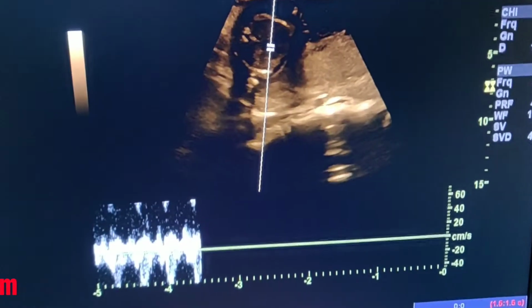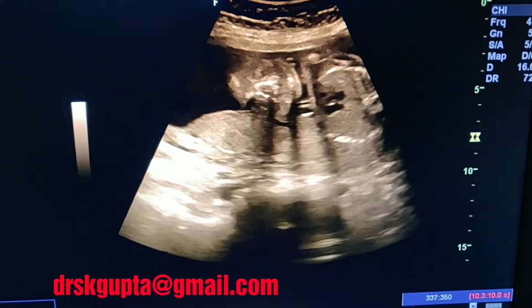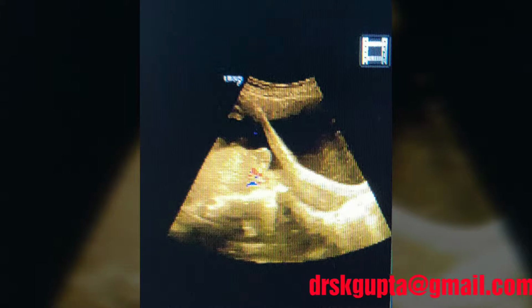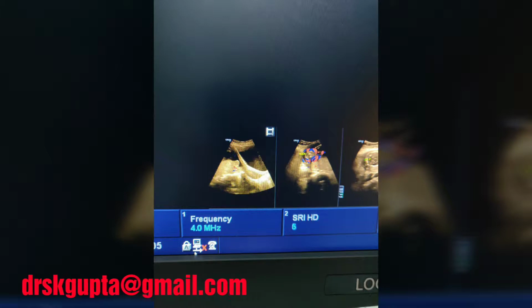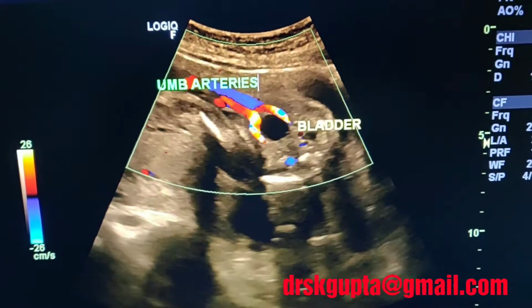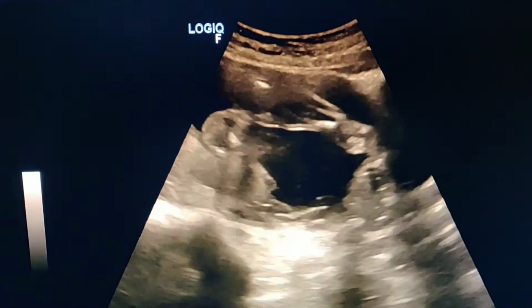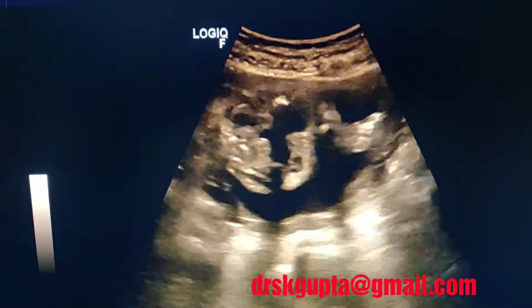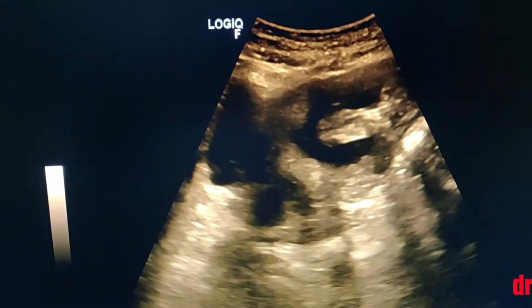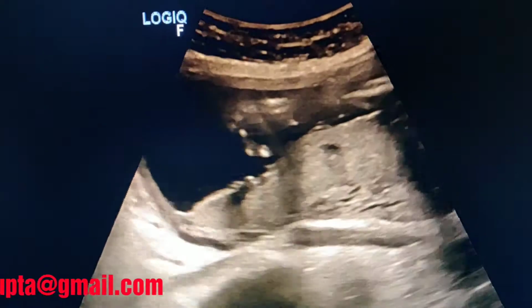Measure the heart rate. These are the fetal kidneys. This is the placenta previa again. The umbilical arteries over the bladder of the fetus, which is well filled. Full bladder means that the kidneys, at least one of the kidneys, is functioning well. And while assessing the fetal parts, you assess the fluid also. See the hand of the baby with the digits.